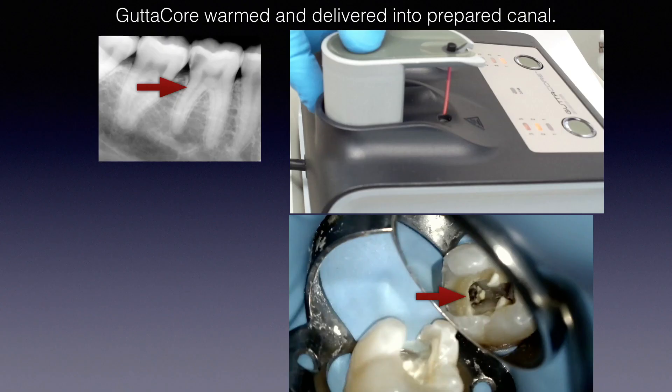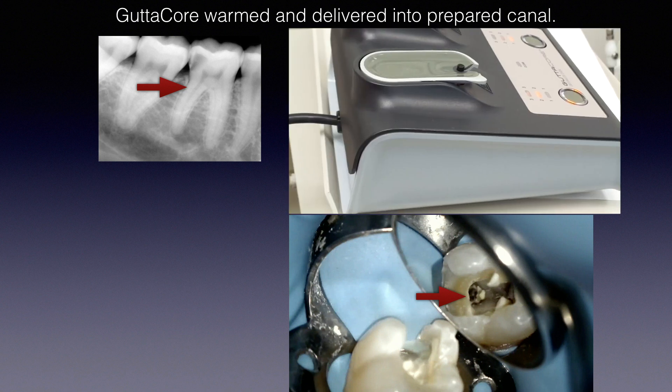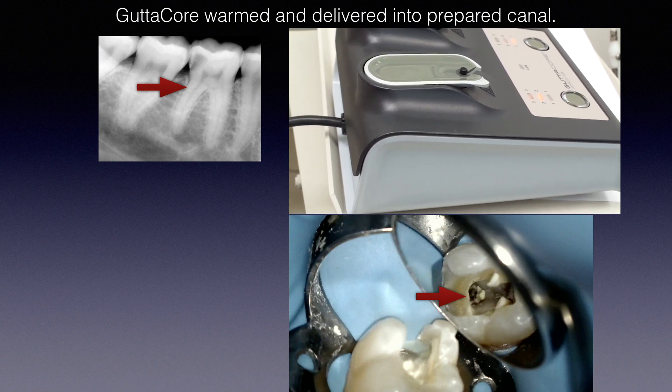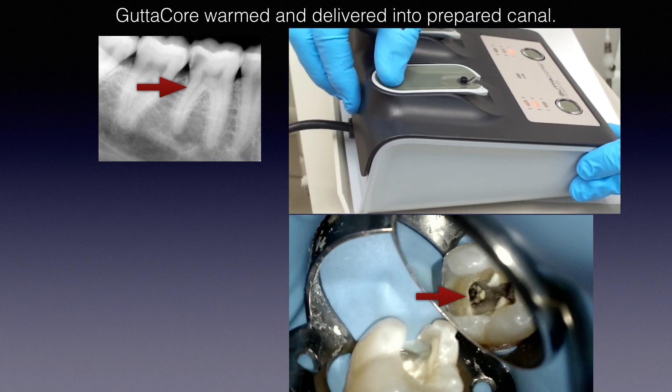Place the carrier-based obturator — the Gutta-Core — in the oven. It takes about 15 seconds, just enough time to make sure everything is in order clinically. When the light on the top right starts to blink, that little circle indicator means it's warm enough and we're ready to go.